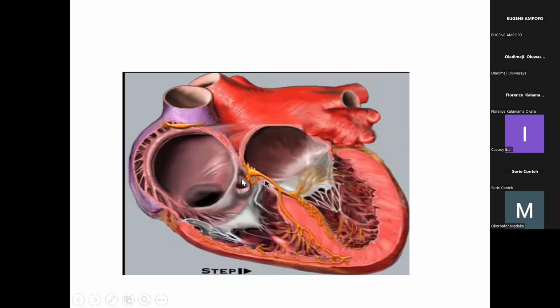Also, it's important to know the location of the coronary sinus, the CS, because the catheter will pass through it to the back of the heart where the coronary sinus is, and is going to be detecting activity between the left atrium and the left ventricle.